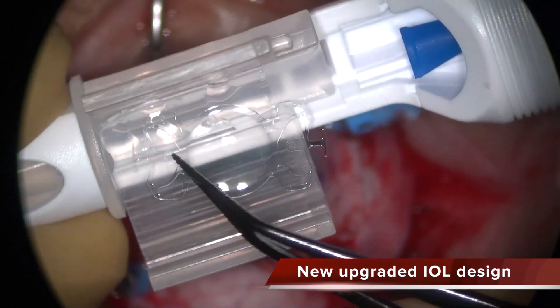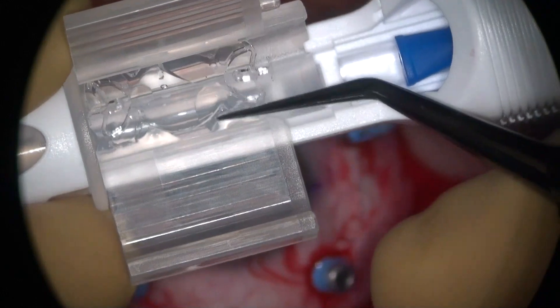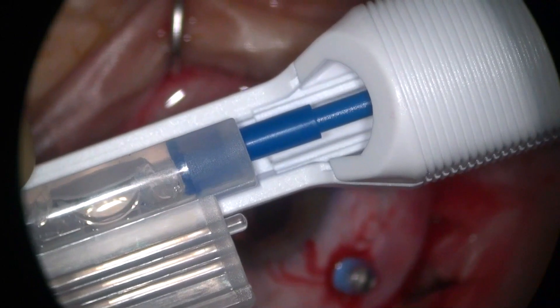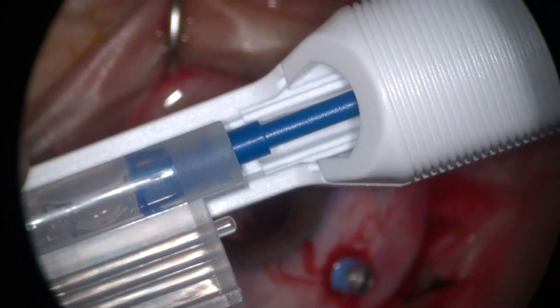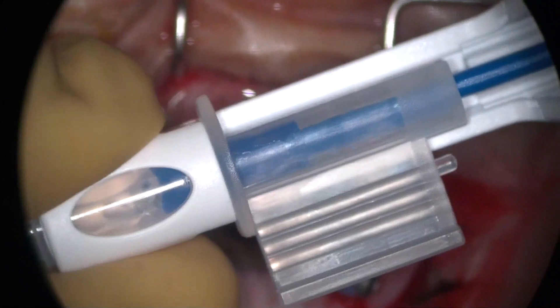This is the new IOL design. It's much easier to fold into the cartridge. You see this cartridge — initially it has a screw to advance the lens into the cartridge, and then you unfold the wings of the injector and then you can inject it single-handed.